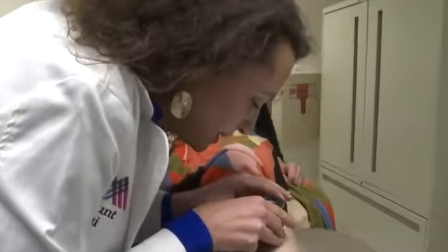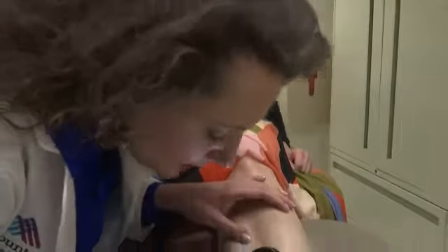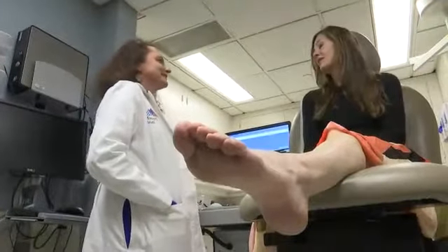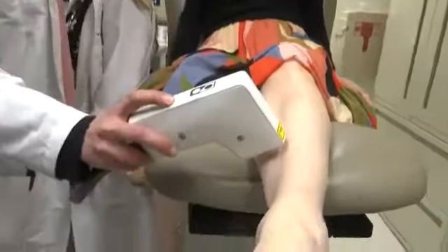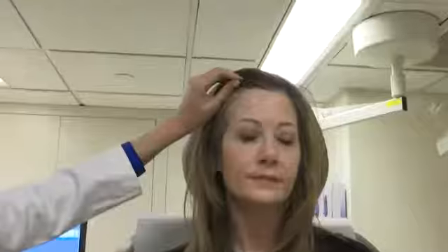With OCT, Markowitz is able to tell her whether an anomaly on the skin is the beginning of a basal or squamous cell carcinoma before the tumor really starts to form. In a study conducted by her team, 48% more basal cell carcinomas were detected through OCT than by regular clinical examination. In addition to preventing unnecessary cutting in cosmetically challenging areas, it's also to be able now to diagnose things substantially earlier in cosmetically challenging areas.